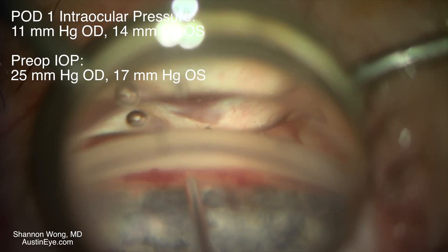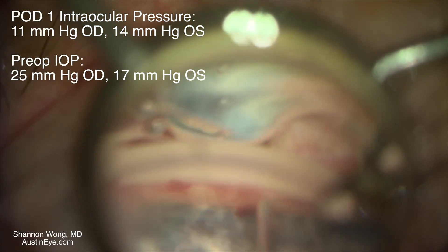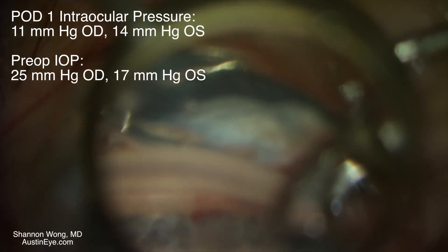We then use viscoelastic to viscodilate the collector channels in Schlemm's canal. This patient did well postoperatively and had an excellent reduction in his intraocular pressure.